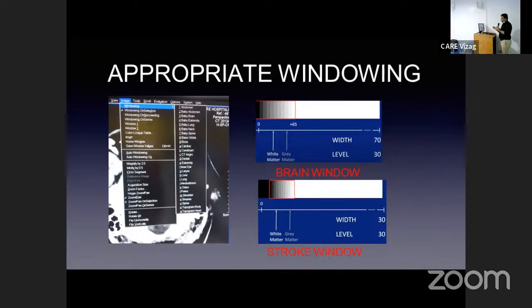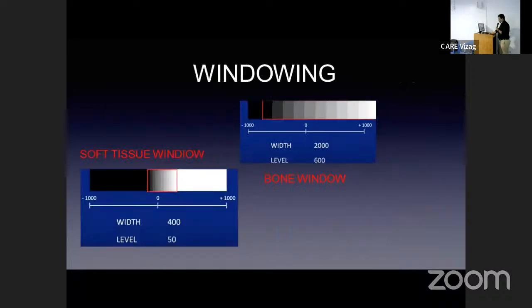Because we are confining the window width and the window level. If anybody wants to ask any questions regarding window width and window level, I'll be happy to answer. If not, then I'll start with the anatomy.